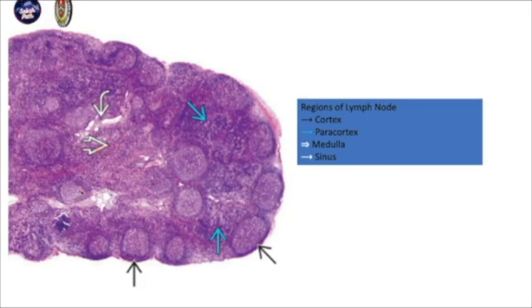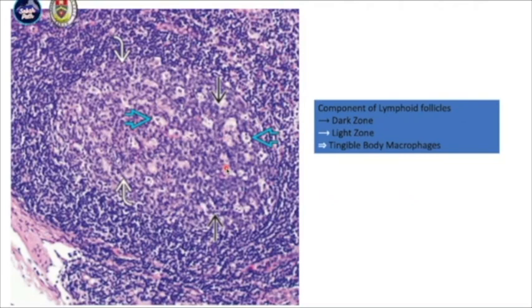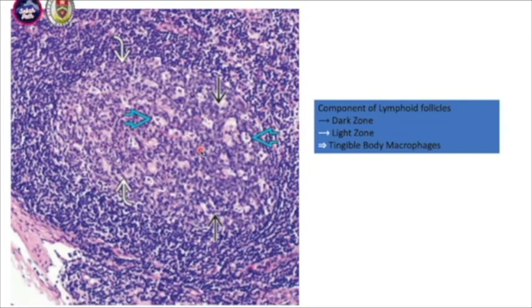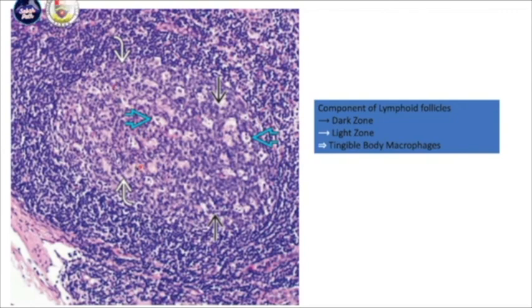This is how a low magnification of a benign lymph node looks like. If you look at the higher magnification, you can see the lymphoid follicles. In benign lymphoid follicles, you have a dark zone and lighter zone. In the dark zone, you have centroblasts, and in the lighter zone, you have tingible body macrophages and some mature B lymphocytes and T helper lymphocytes within the lymphoid follicle.